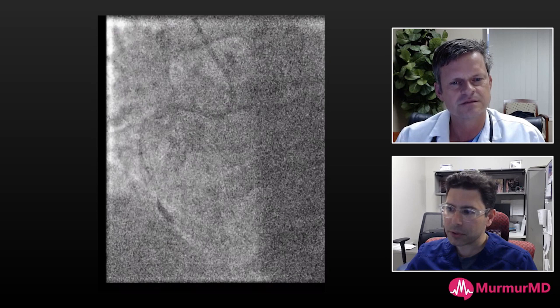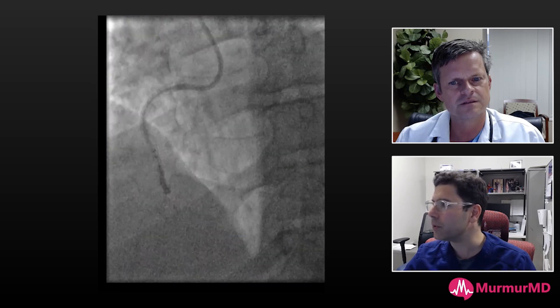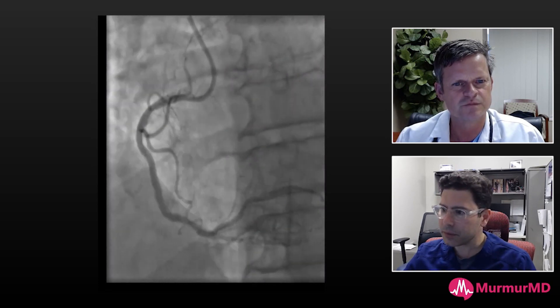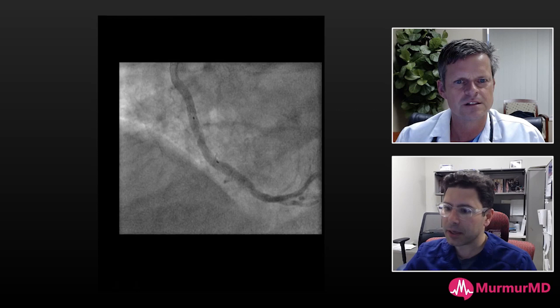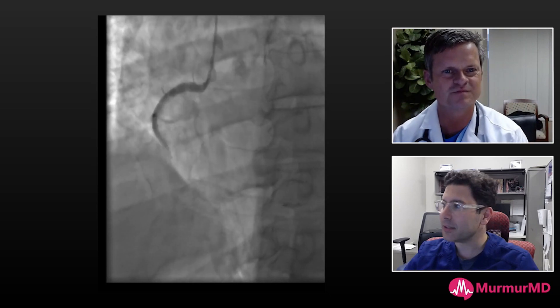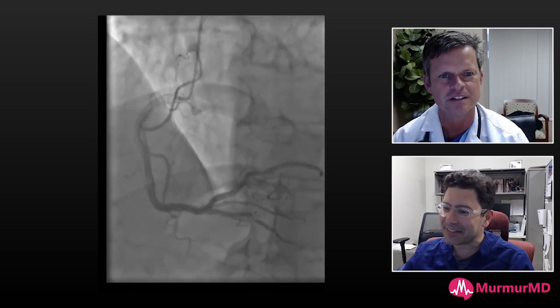Finally it made it through, and we're shockwaving distal to proximal. The procedure ended up successful. Fast-forwarding to the final result — in the LAO view it looks good, but in the RAO there's some haziness, some of it from calcium. Unfortunately the patient presented two and a half weeks later with chest pain. My partner cath'd him, and thankfully the right coronary looked fine at that point — I'm not sure what was going on with him.